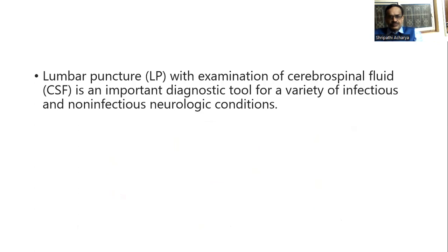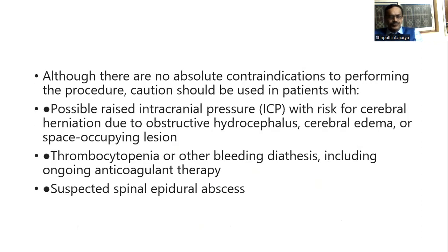Lumbar puncture with examination of cerebrospinal fluid is an important diagnostic tool for a variety of infectious and non-infectious neurologic conditions. Although there are no absolute contraindications to perform the procedure, caution should be used in patients with: 1. Plausible raised intracranial pressure with risk of cerebral herniation due to obstructive hydrocephalus, cerebral edema, or space occupying lesion.